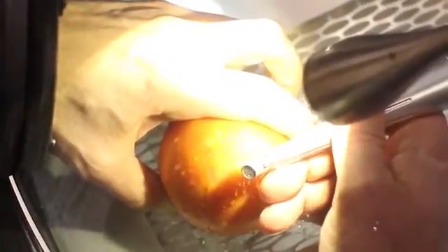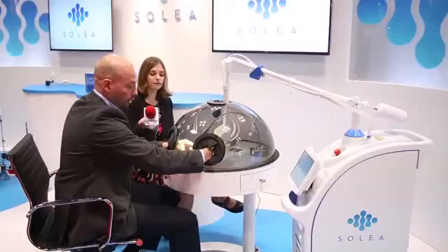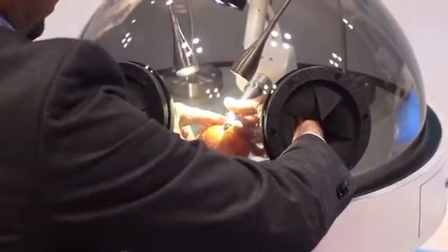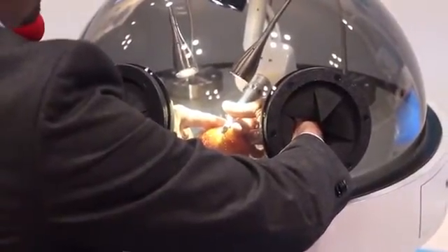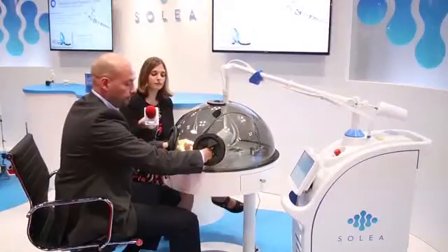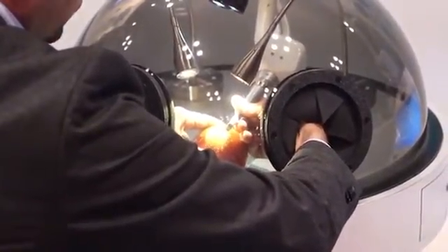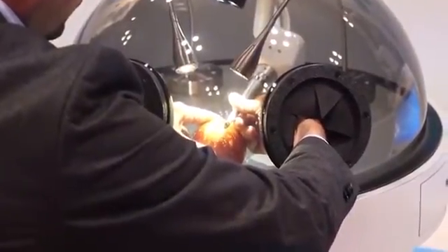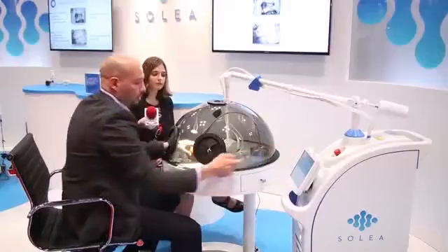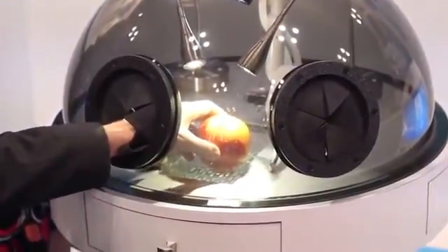So the beautiful thing about Solea is its precision. We're able to just ablate the soft tissue in a smooth and exact manner. And we can do that with a 90 degree angle or we can actually go at an oblique angle and go in a split thickness area of the tissue or choose a larger spot size. So this simulates a gingivectomy where we're just sculpting the gingiva, or troughing around a crown, or a phrenectomy, or other procedures like that.